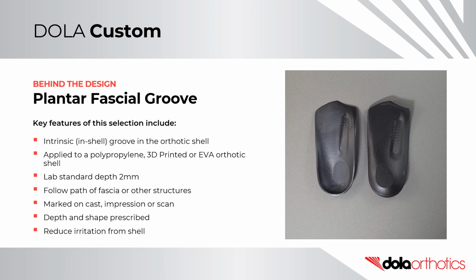It can be applied to a polypropylene, 3D printed or EVA orthotic. 2 mm is the lab standard depth. It can follow the path of the fascia or other structures. It can be marked on a cast, impression or scan. The depth and shape can be prescribed by the practitioner, and it can be used to reduce irritation from the orthotic shell.